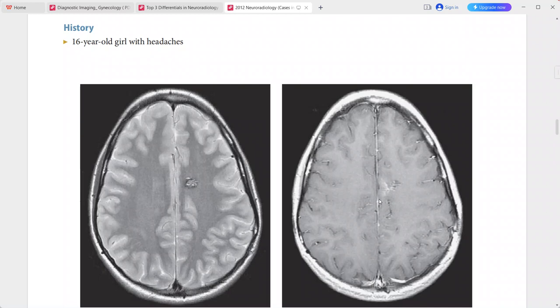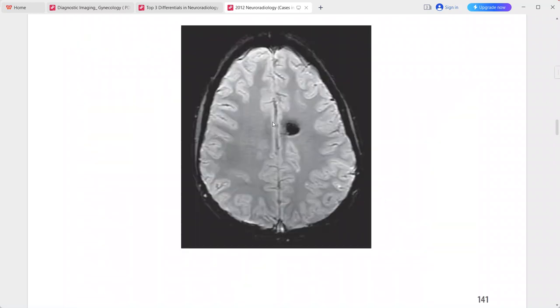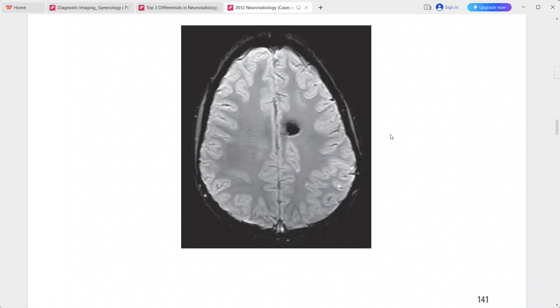SWI shows blooming signal loss associated with this lesion, corroborating the presence of blood products. This is a typical imaging picture of cavernous malformation (cavernoma). Differentials include hemorrhagic metastasis, arteriovenous malformation, amyloid angiopathy, and diffuse axonal injury.